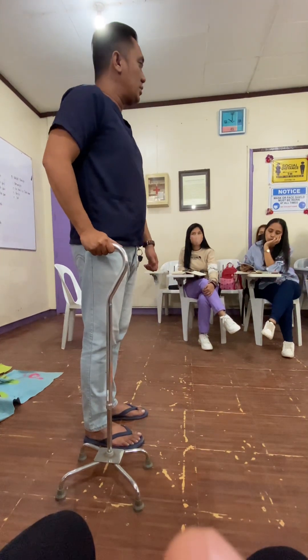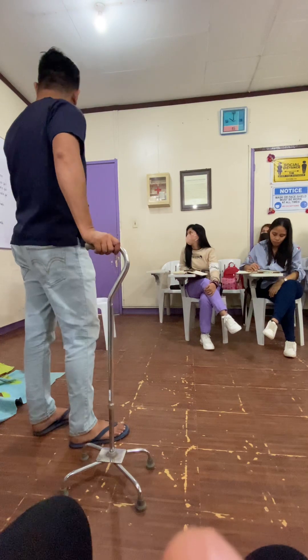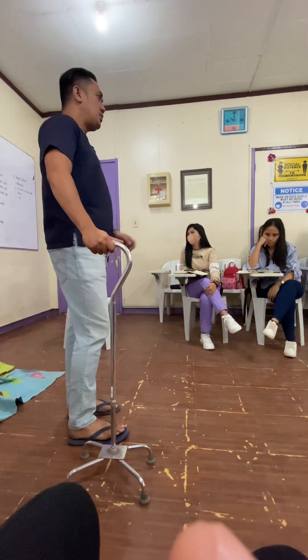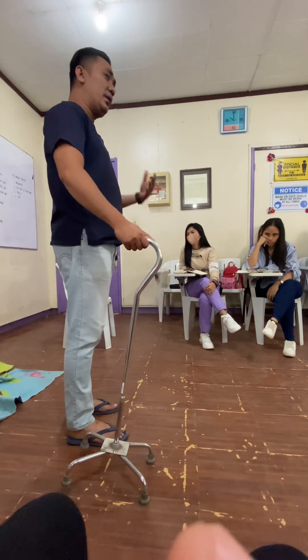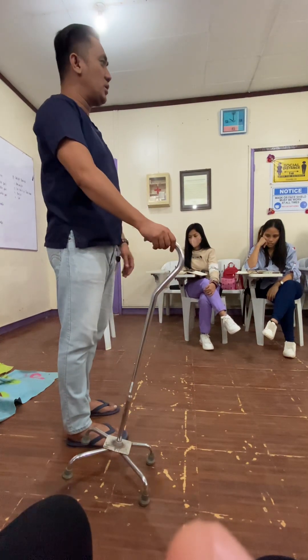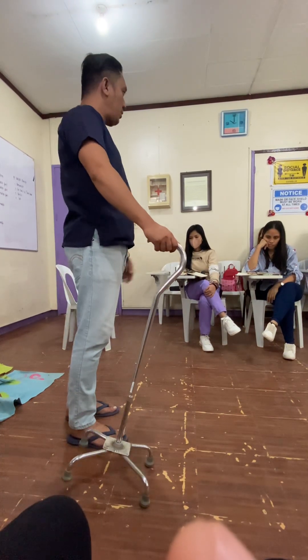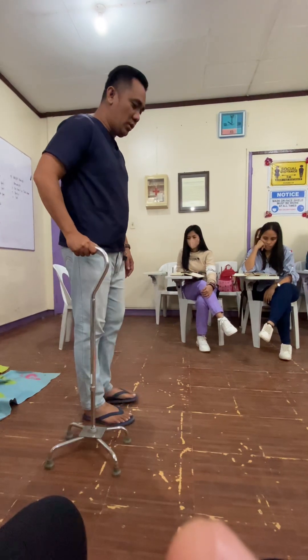So there are two walking patterns for the cane: we have step-to and step-through. Step-to is the first walking pattern that patients learn. And once the patient is already confident with walking using the cane, then they will move on to step-through. So how does a patient walk using step-to?